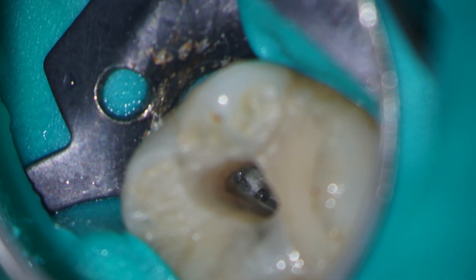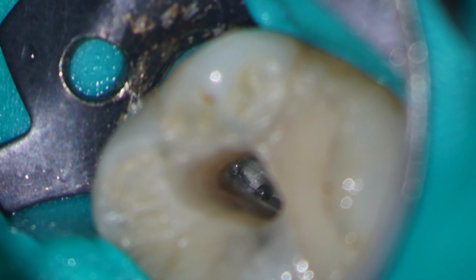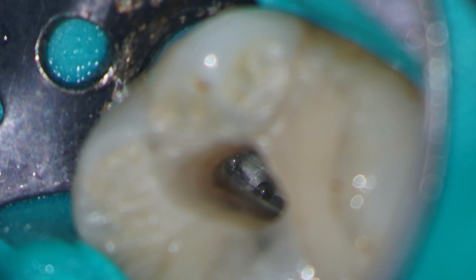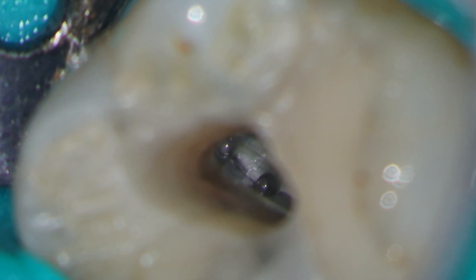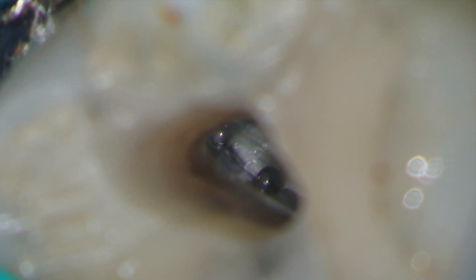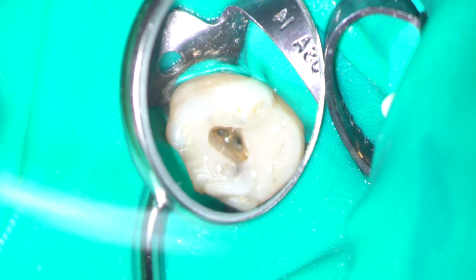Here you can see the prepared MB1 and MB2 canals. They had confluence between them as we suspected from the CBCT prior to treatment.